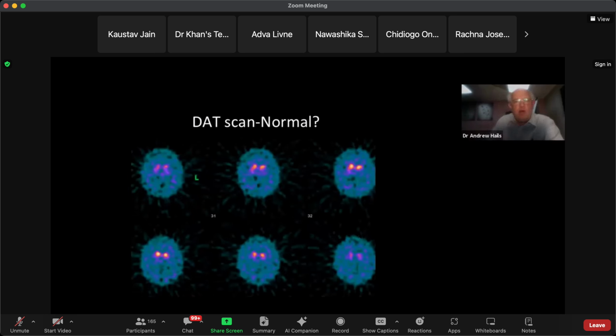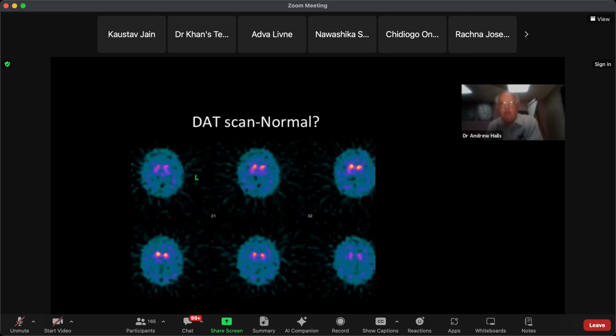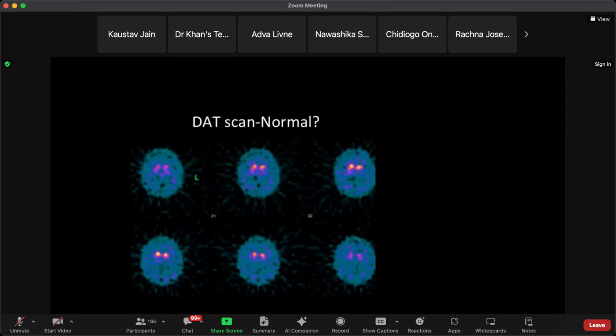So, what might this patient have got? Probably Parkinson's, because you've no longer got the normal comma configuration. You've got dots. That's right. Basal ganglia. So there's a problem with the dopaminergic system within the basal ganglia. So they're most likely going to have a Parkinsonian presenting symptom.